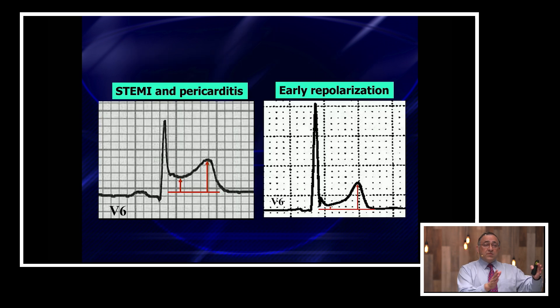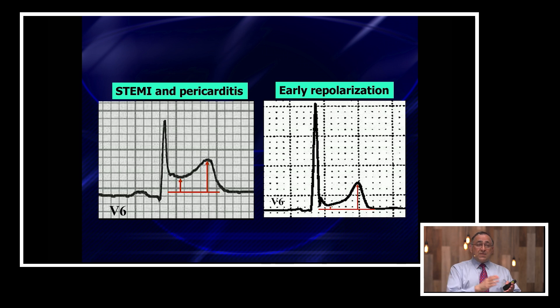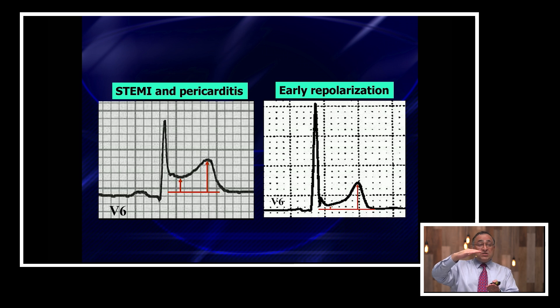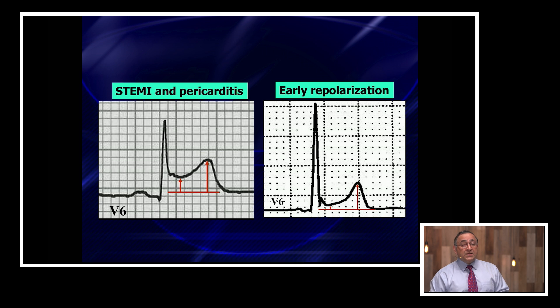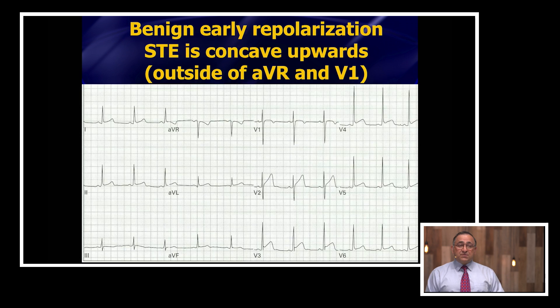Let's put these next to each other. On the left, you can see what STEMI and pericarditis look like in V6; on the right is early repolarization. Early repolarization produces just a little ST elevation compared to a big T wave, whereas STEMI and pericarditis give you a lot more ST elevation compared to a slightly taller T wave. This is a very nice pearl that appears to be quite reliable — unfortunately it only works in V6, and only if there is ST elevation in V6. If there's no ST elevation in V6, you can't use this pearl.